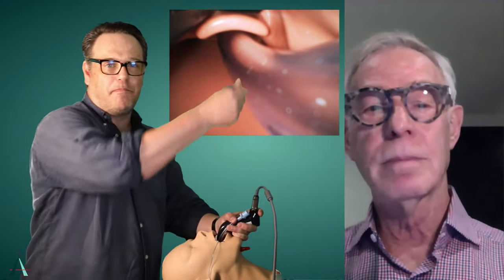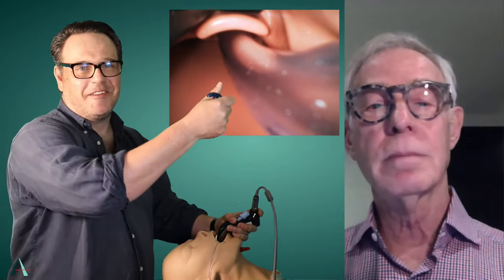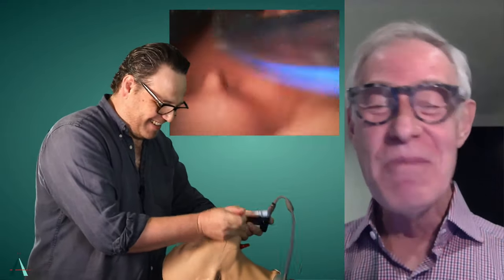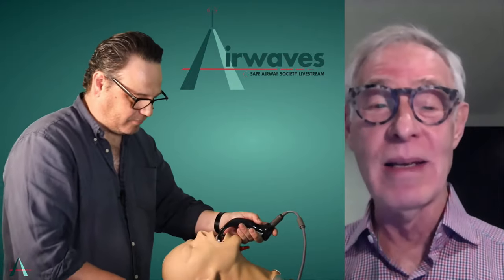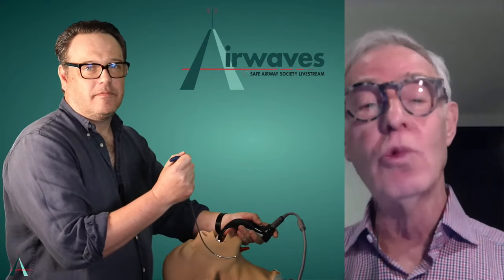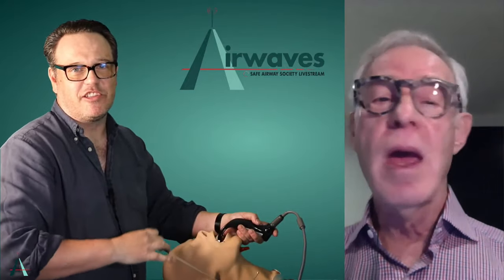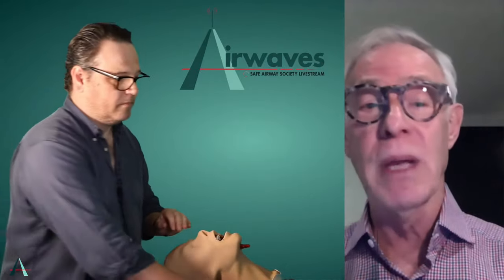And the dangers of just pulling this up, Richard? You'll end up doing a sagittal split. It will not come out easily that way. But it comes out very easily if you just roll it out in a reverse fashion. Yeah, and because it gets stuck, people tend to pull harder and harder and jerk, and then can potentially dislodge the tube. Exactly that. And so I would leave the laryngoscope in until my stylet is out, confirming that the endotracheal tube is still properly placed.